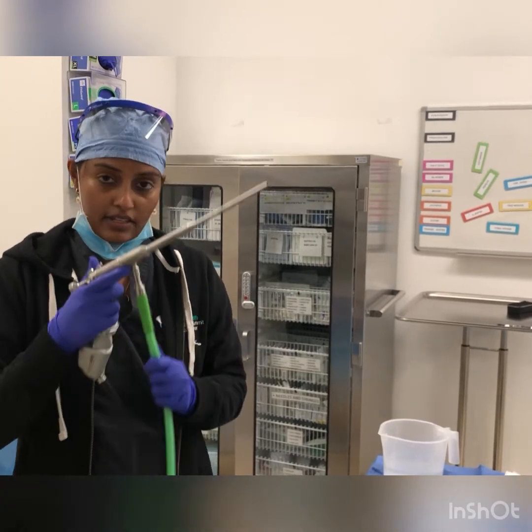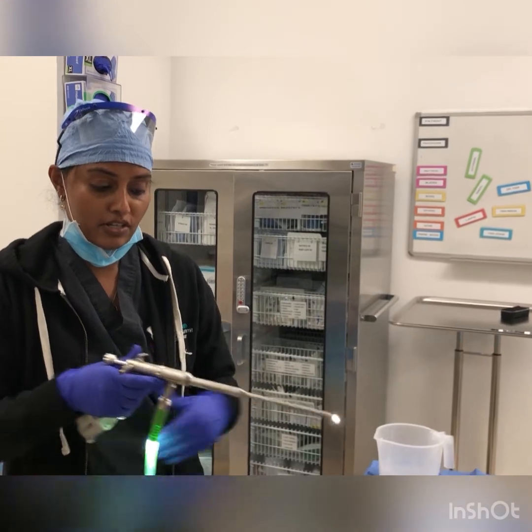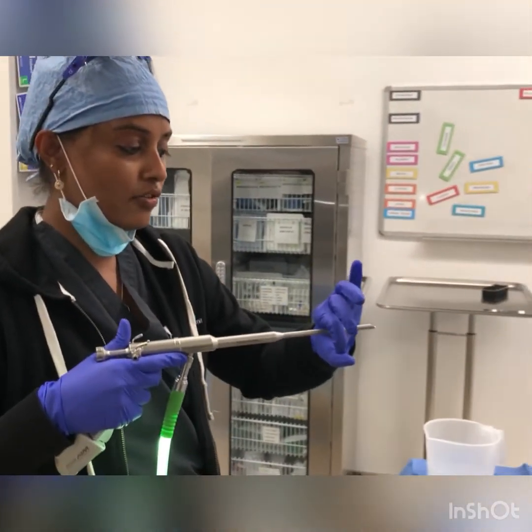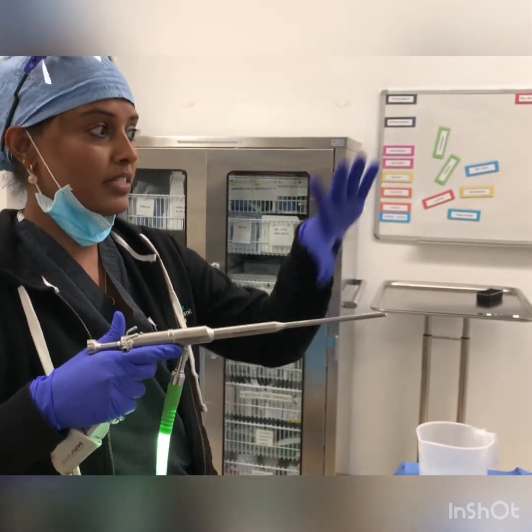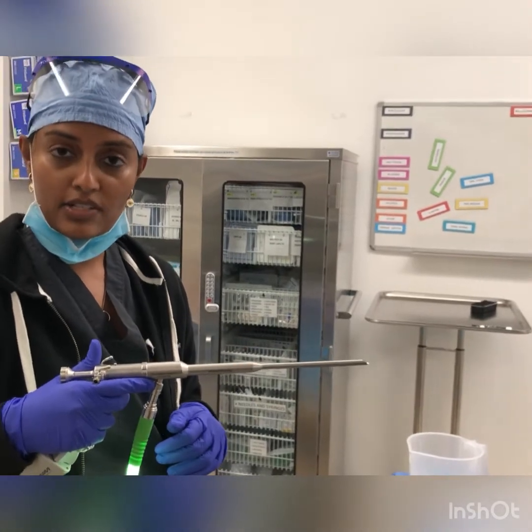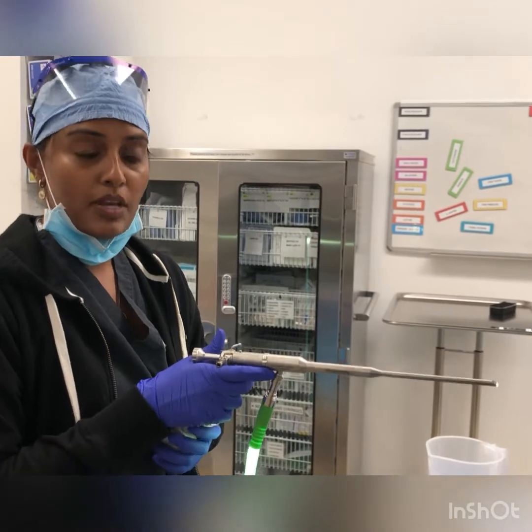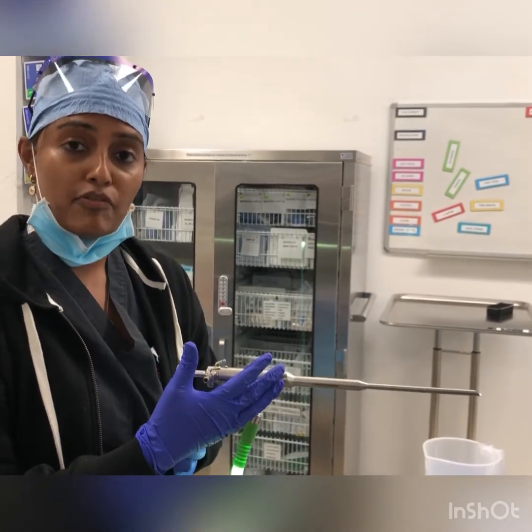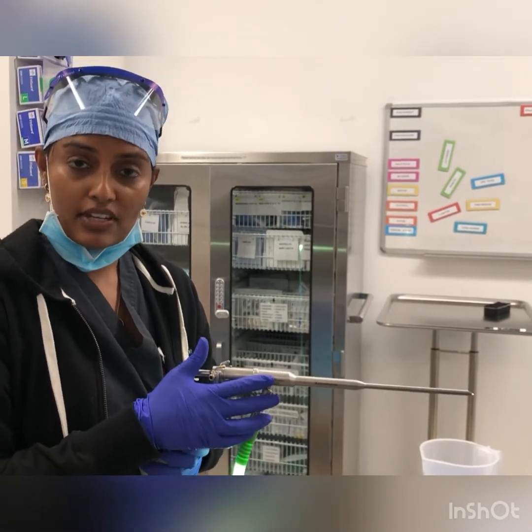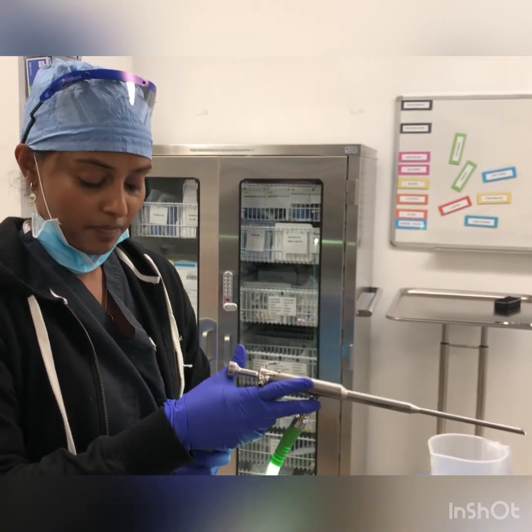It has a light, there's a light cord, and when I turn it on, I can put it right through a patient's cervix, as you can see right here. When I get to the uterus, I have some light, and it's going to help me see what's going on in the uterus. If I had fibroids like the ones I showed, I'm going to be able to see them. Then I'm going to be able to use different types of blades to shave these fibroids off, so that the cavity can be nice and clean at the end of the procedure and ready for implantation.